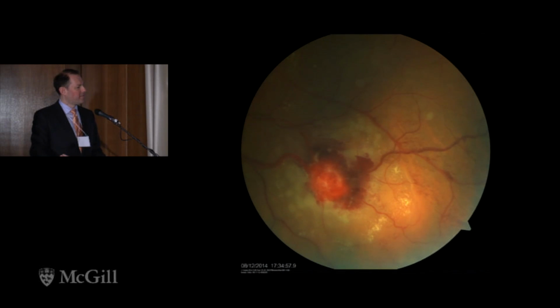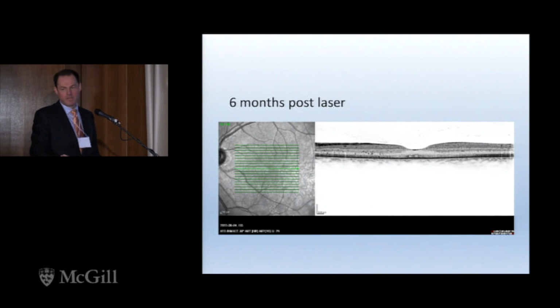So what did they do? Well, they gave it more laser, and they gave this patient PO steroids to try and reduce some of the inflammation, swelling, and exudation. And slowly but surely, it worked. So here's a great example of how OCT helps you follow the treatment of this patient over the course of several months, letting you know how aggressive to be with this patient, whether it be with additional steroids, injections, or laser in this case.